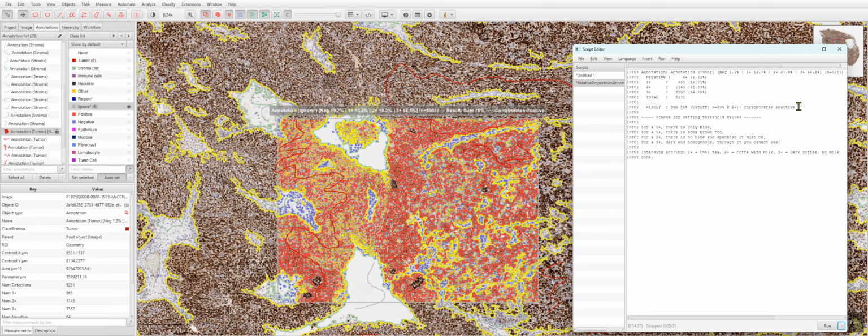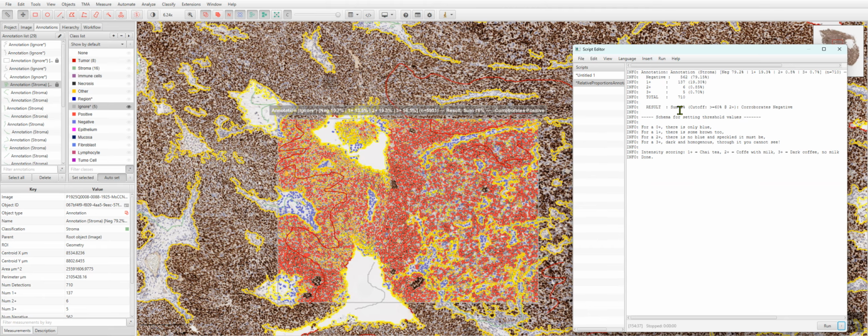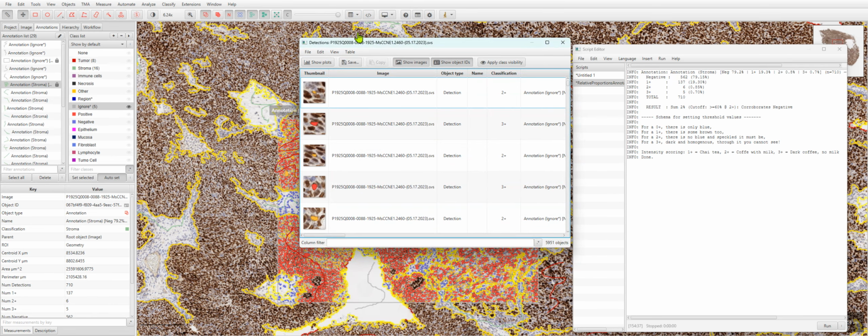This corroborates a positive. Here are my individual percentages. Now, I want to prove that I'm just looking at the tumor cell fields, so the next thing I want to do is run this same algorithm on just the tumor-induced stroma, and it should go from 86% down to 2%. So I know that I'm looking at the tumor cell field and the tumor-induced stroma separately, and that's really a nice capability to have.